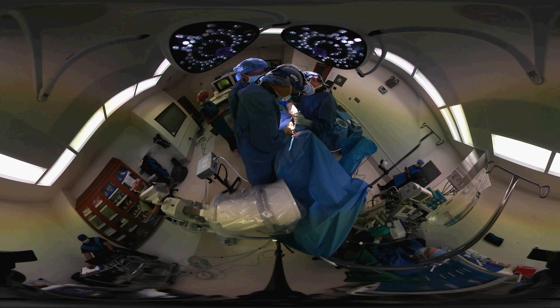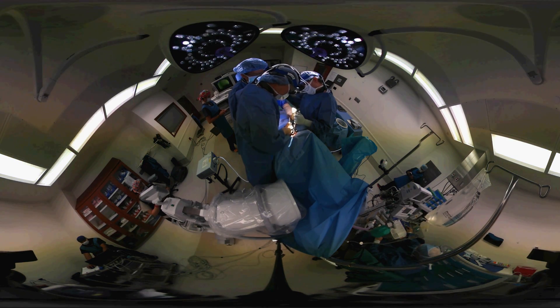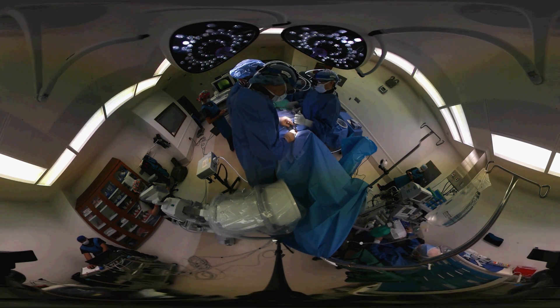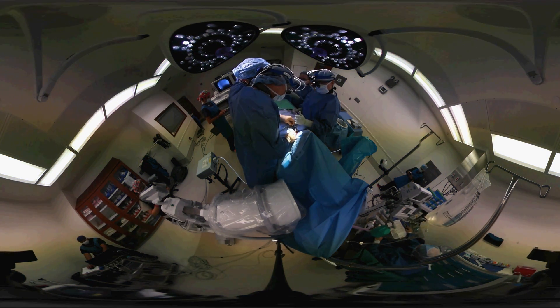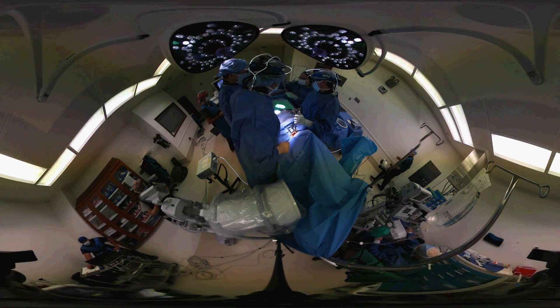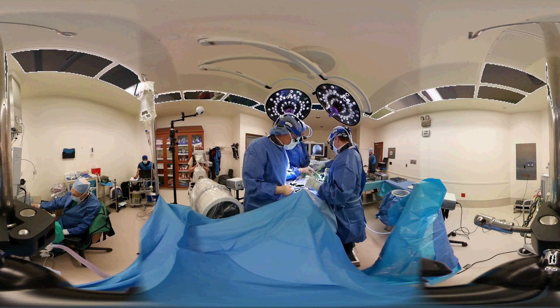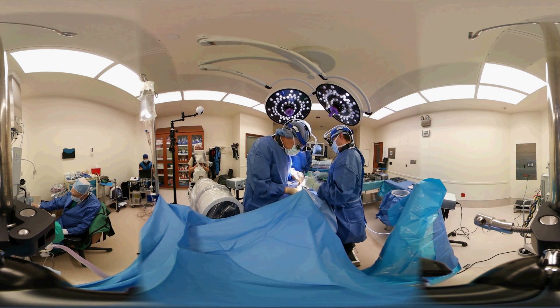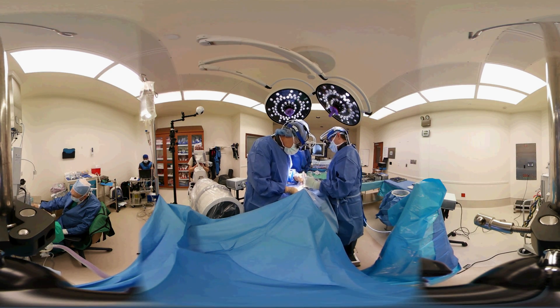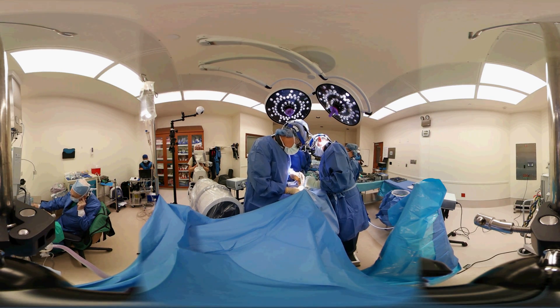At this point I'm beginning to clear out the disc. There are little tiny instruments, like Pac-Man instruments, that we use to actually remove the disc itself. We have to remove the entire disc so that we have just bone exposed, because it is the bone that will attach to the artificial disc to securely lock it in place — this takes somewhere between six and twelve weeks after surgery. I continue the discectomy and then we go back into the spinal canal to remove ligaments from behind, making certain we have removed all disc or bone spurs that are pinching the patient's nerve so they will have relief of their arm pain after surgery.